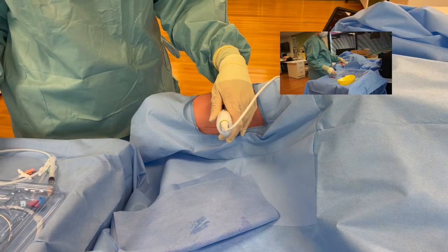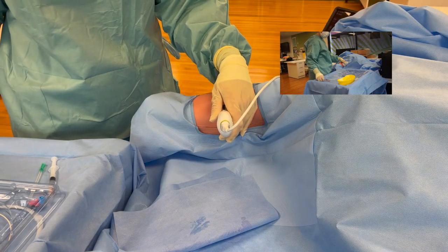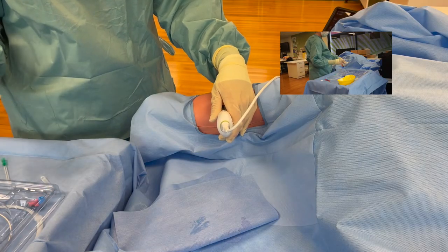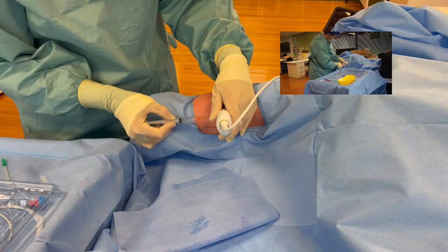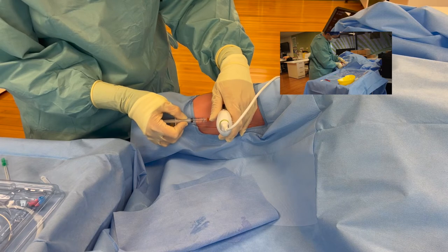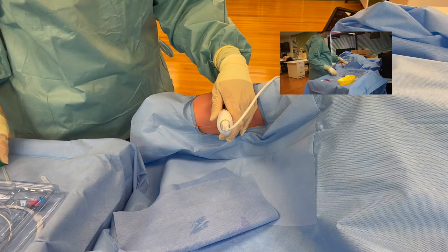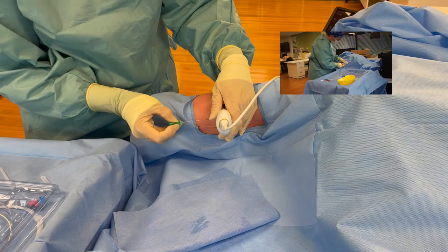You may wish to spread out your items a bit more so they're in a nice orderly fashion, remembering to maintain your image on the screen - don't drift. You will take your intradermal injection bevel up, very shallow angle just underneath the skin, and inject looking for a bleb. Once you've seen that, you will pull your sharp out and pop it straight in your sharps zone.